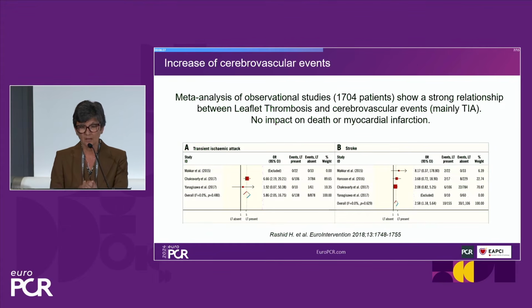The time after the procedure was variable for the CT scan follow-up because these were observational studies. And as mentioned by Nicolas, the HALT phenomenon sometimes recovers, sometimes can reoccur spontaneously without any treatment. The other limitation of the observational studies is the lack of strict definitions. At that moment of the HALT analysis by CT scan, there was no core lab to define exactly, with a robust method, the presence and the characterization of HALT.